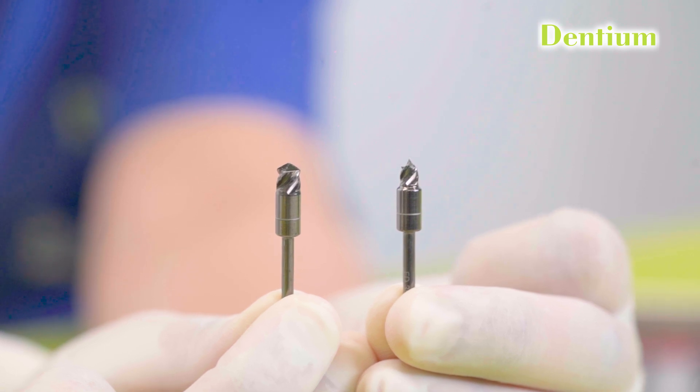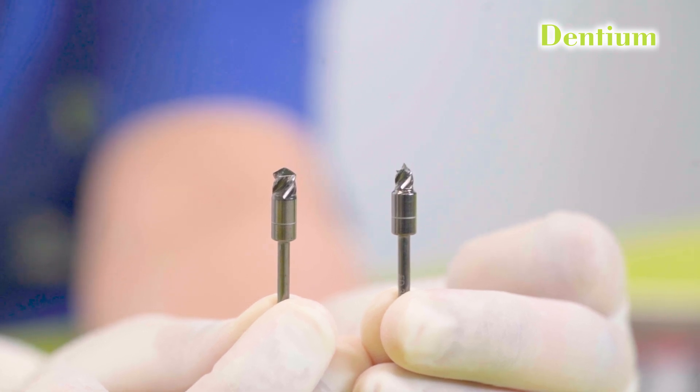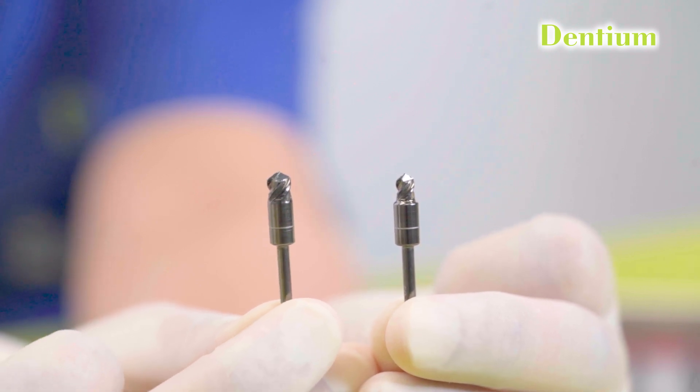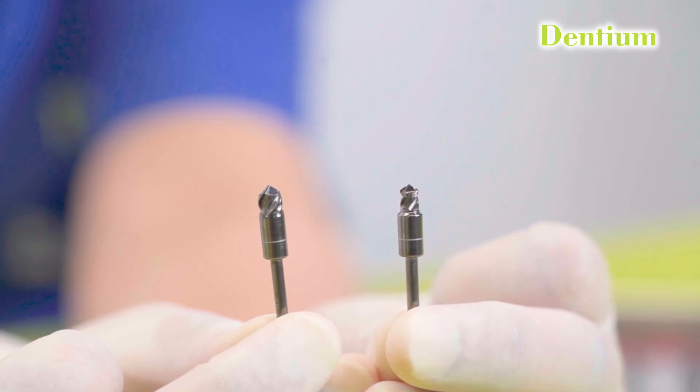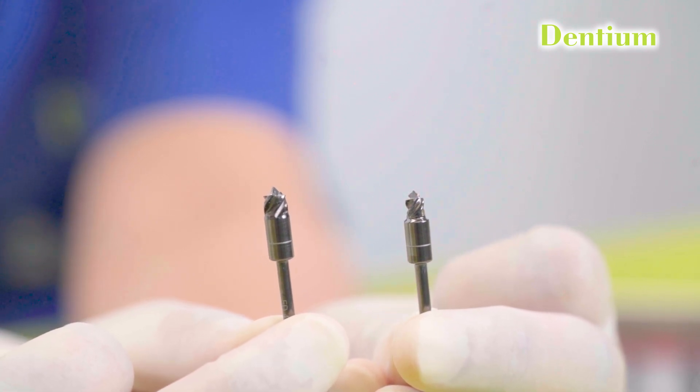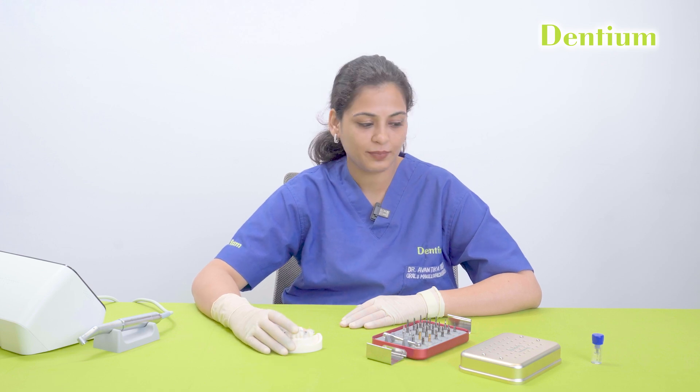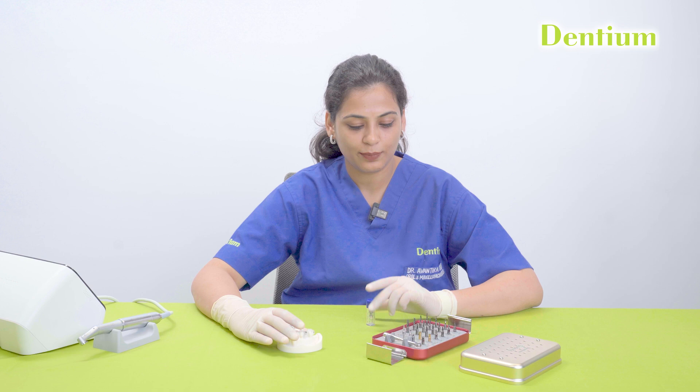The flat drill is used in narrow ridges and irregular alveolar bone to create a flattened bone surface, preventing potential bone interference during subsequent surgery stages. I have prepared a surgical guide for this dummy model and I will be placing a 4.5 by 10 mm implant with the help of this Dentium Superline surgical guide kit. Let's start the procedure.